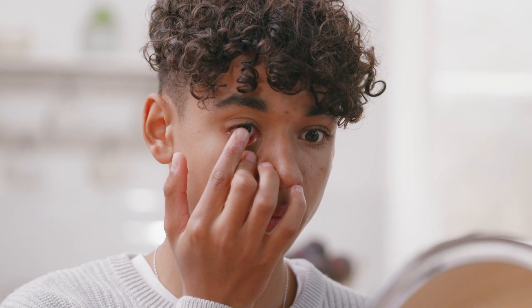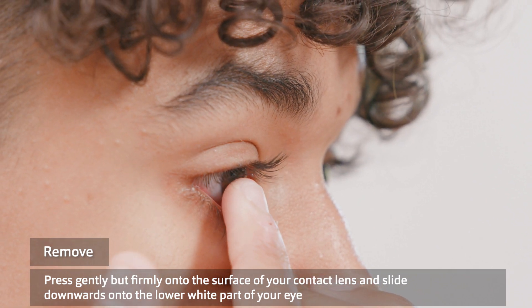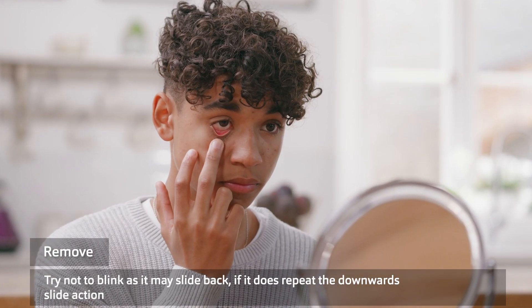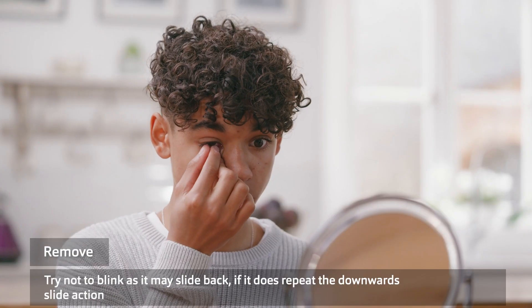Now tip your chin down a little so that you're looking up into the mirror and there is more white underneath the colored part of your eye. Press gently but firmly onto the surface of your contact lens and slide the lens downwards onto the lower white part of your eye. If you can, try not to blink, as the lens may slide back into place. Not to worry if it does — just repeat the downwards movement of the contact lens.